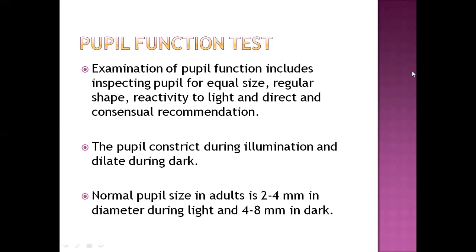Pupil function test. Pupil function test is examination of pupil function. That examination includes pupil size, regularity, shape, reaction to light, and consensual reaction. So in pupil function test, we determine whether the pupils of both eyes have equal size, regular shape, and reactivity to light.